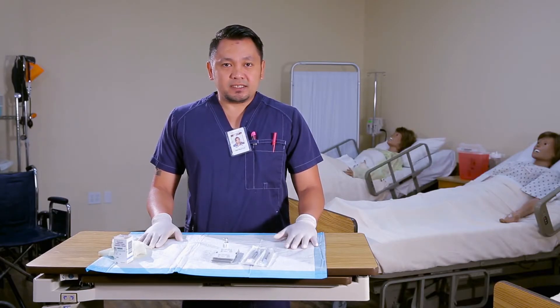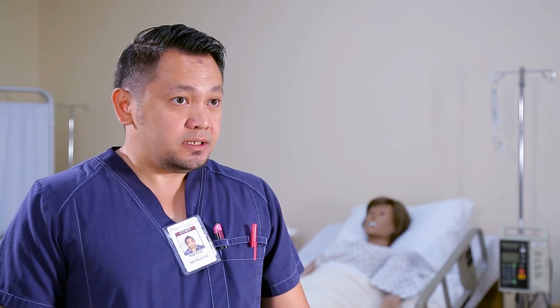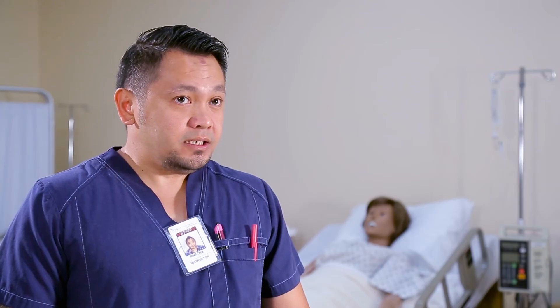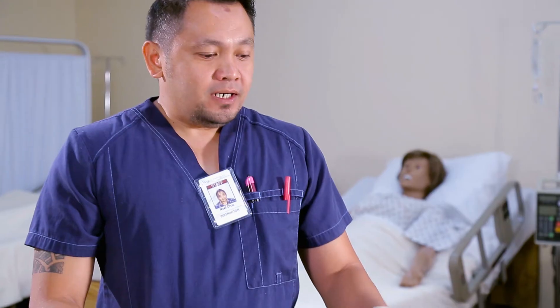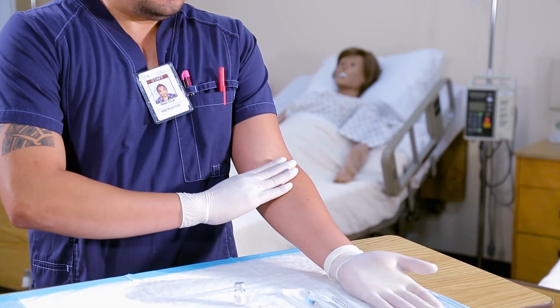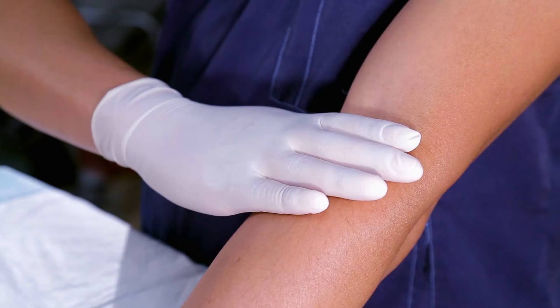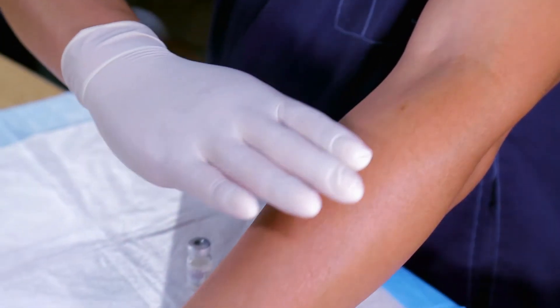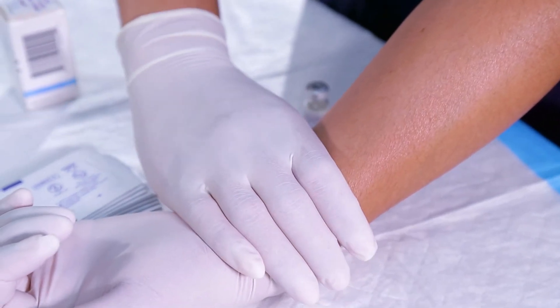When selecting the injection site, inspect the skin for bruises, inflammation, edema, masses, tenderness, or any sites of previous injection. The forearm site should be 3 to 4 finger widths below the antecubital space and one hand width above the wrist, or the inner aspect of the arm.